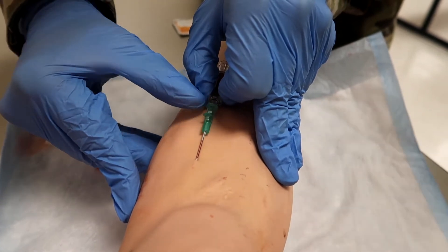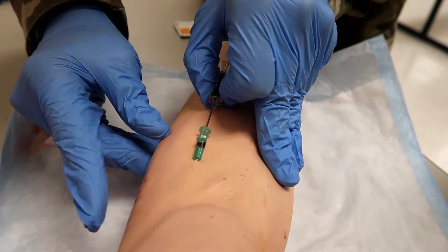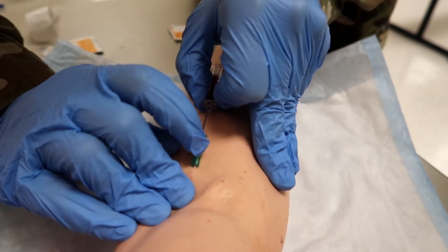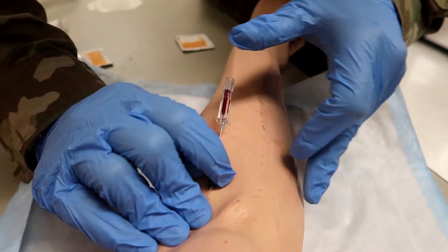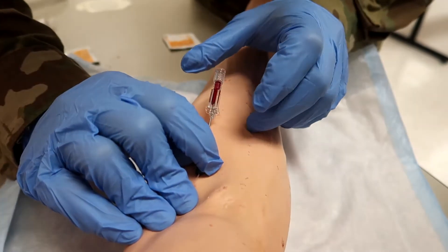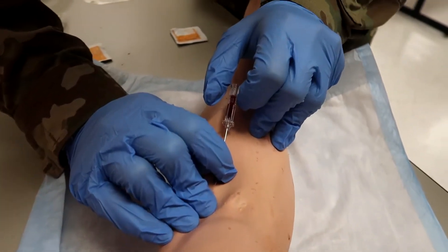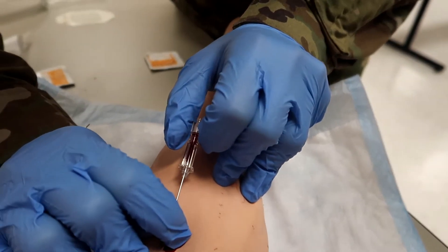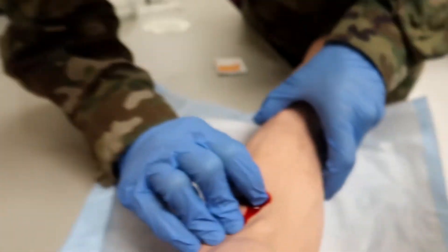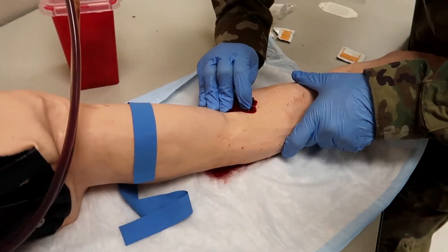He's going to decrease the angle of the needle catheter 10 to 15 degrees and advance one-eighth of an inch — you do this so the catheter doesn't kink when you advance it all the way. He's going to advance the catheter until the hub touches the skin or until significant resistance is felt. That went in nice and smooth. He's going to go ahead and occlude, then release the constricting band before doing anything else — constricting band is gone. Since he's occluding, hardly any blood is coming out, which is normal. Now he will remove the needle and place it in a sharps container.